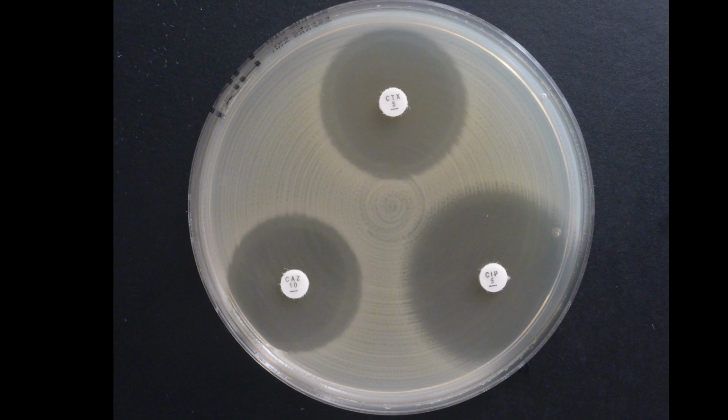As I said before, the agents could be selected among the ones that are important, but of course, to make sense of a reading exercise, you should select both agents for which zones are easy to read and those that are difficult to read. So if we take Staph aureus as an example, cefoxitin is a very important disc. It's usually very easy to read with sharp zone edges. So that's a good example to have in there to see what happens when we read a zone diameter with very sharp and defined zone edges.